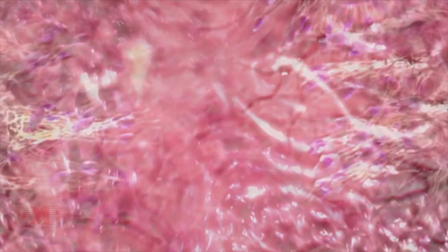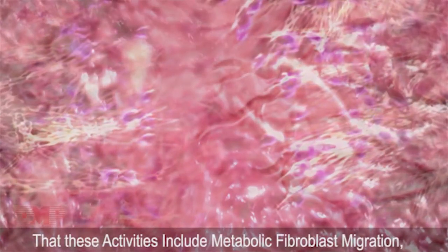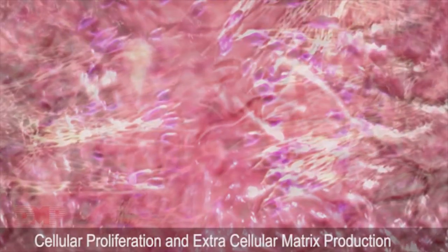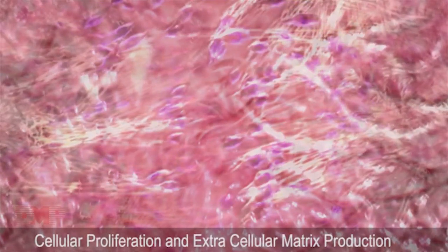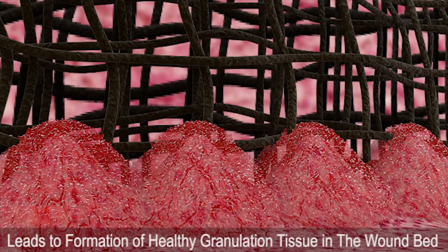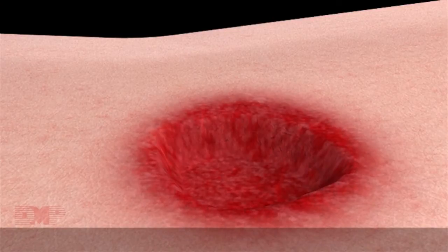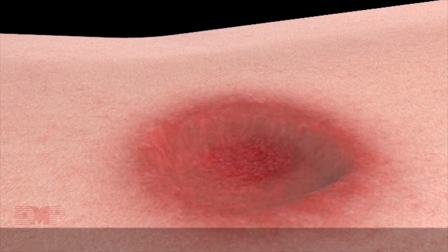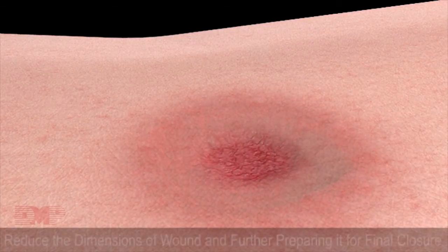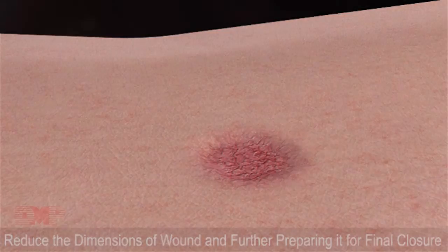In vitro and in vivo studies conducted using negative pressure have shown that these activities increase metabolic fibroblast migration, cellular proliferation, and extracellular matrix production. All of this cellular activity leads to formation of healthy granulation tissue in the wound bed. Over subsequent dressing changes, granulation tissues fill the wound bed and reduce the dimensions of the wound, further preparing it for final closure.